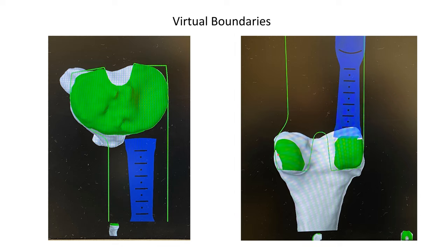This also applies to the femur. This is the cut of the posterior condyles, one of the hardest cuts because you cannot see the end of the blade. With traditional instrumentation, we can tell when we're there by listening for the change in the sound of the blade. We have cues, but this type of very clear visual boundary is much better than an auditory cue.